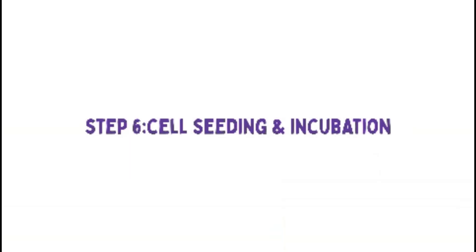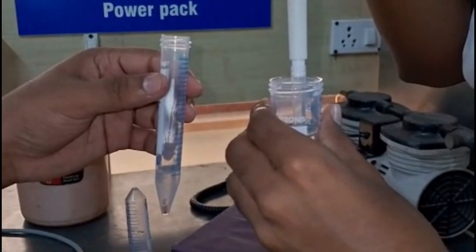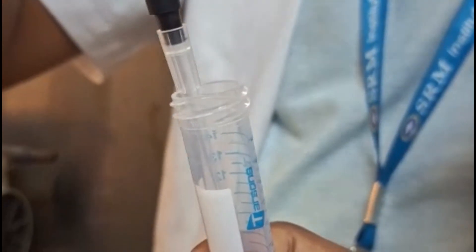Step 6: Cell Seeding and Incubation. Resuspend the fibroblast pellet in fresh culture medium and transfer it to a sterile culture flask. Place the flask in a CO2 incubator at 37 degrees Celsius for 24 to 48 hours. Fibroblasts will adhere to the surface while non-adherent cells will be removed during the media change.